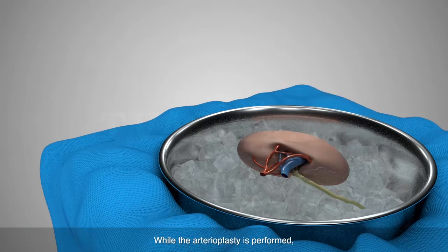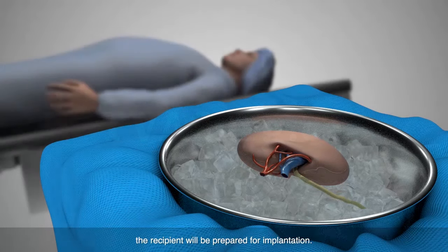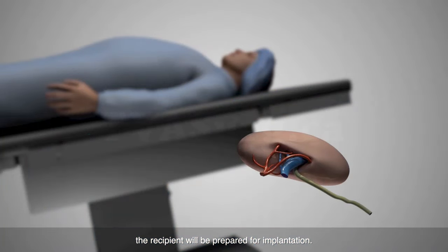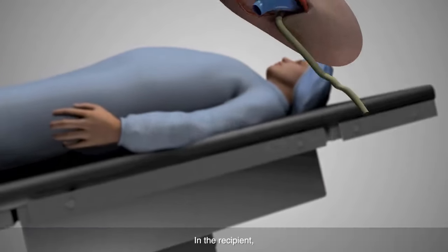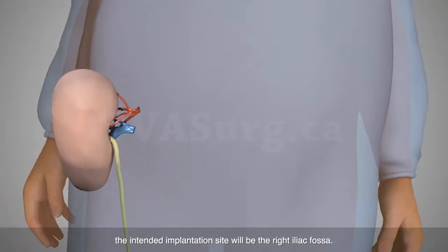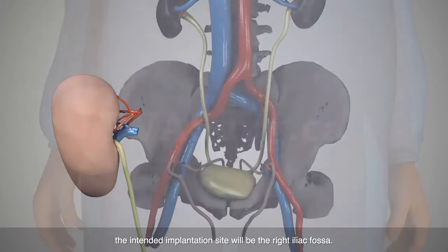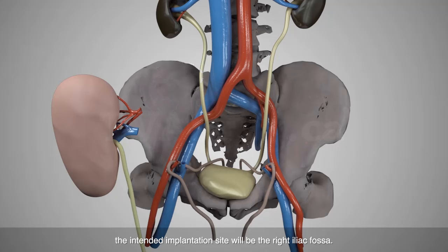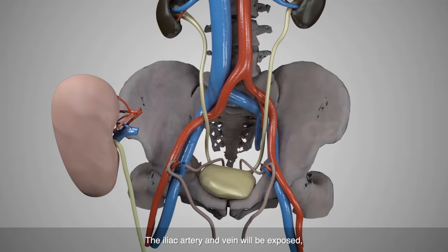While the arterioplasty is performed, the recipient will be prepared for implantation. In the recipient, the intended implantation site will be the right iliac fossa. The iliac artery and vein will be exposed.